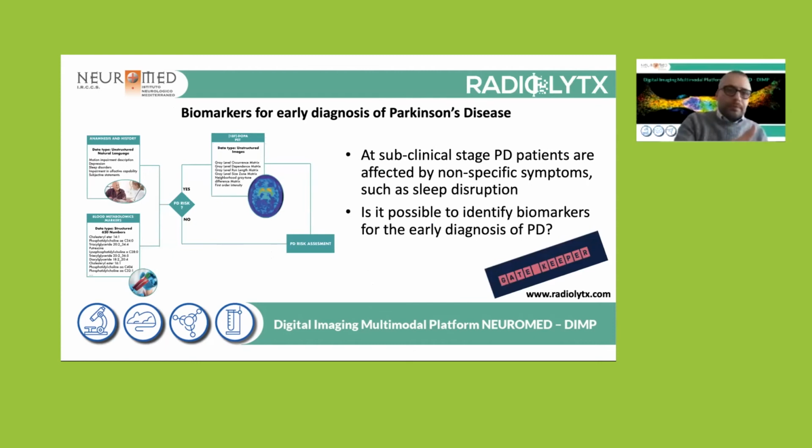So the PET image information can then be bridged to all the other clinical information. What we did until now is to take the image and extract parameters out of it. The parameters are numbers which characterize that image and that patient. But together with those numbers, we may have much more information characterizing the clinical state of the patient.